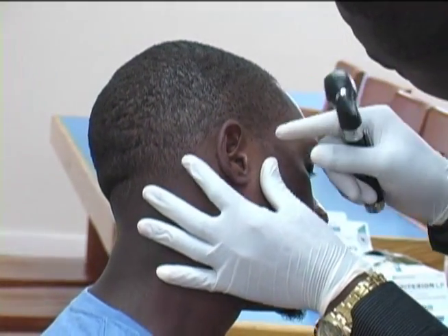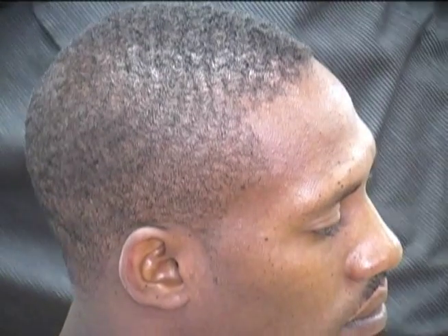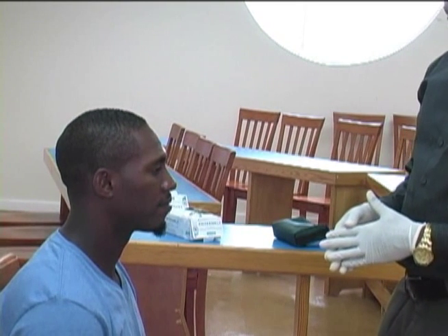Patency. Blockage may be due to wax, foreign body, or swelling. Excessive wax may prevent visualization of the tympanic membrane. Color. Redness may be a sign of infection or recent trauma. Dry, scaly appearance may indicate eczema.